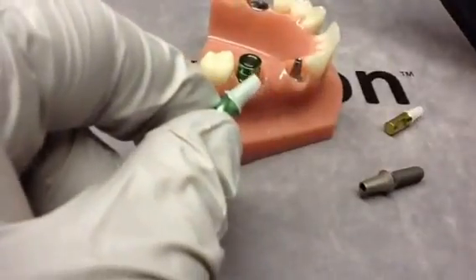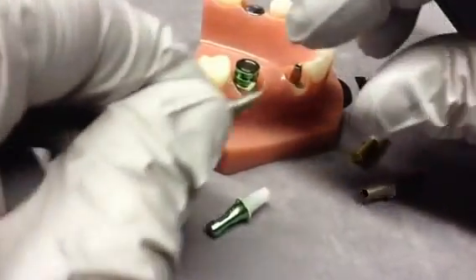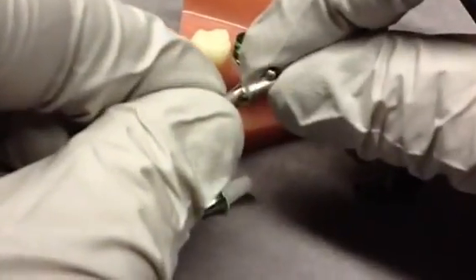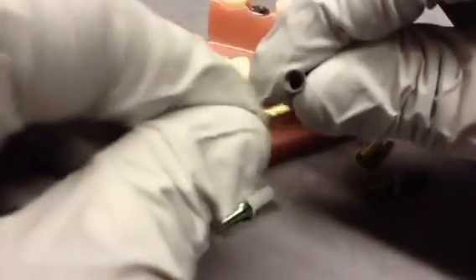The casting will end up being the same precision, and you actually have a very intimate fit to the point where very little cement is required to secure this coping on.